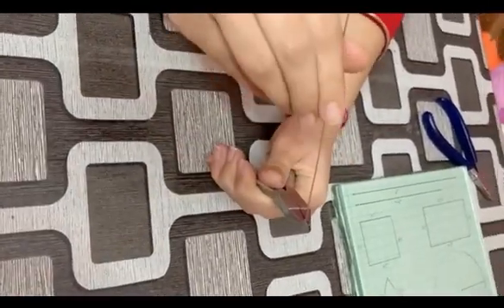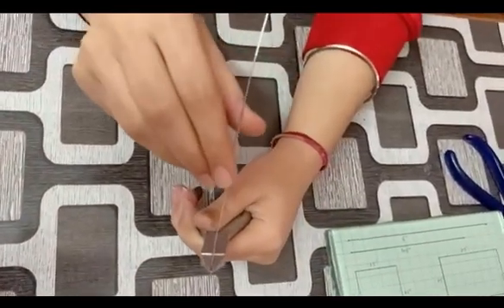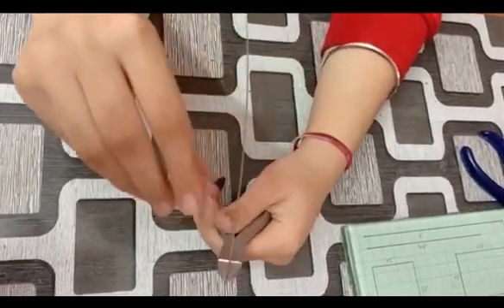Now to check the wire whether it is straight or not, do it by closing one eye and then check. Where there is a bend, you can straighten from that side.